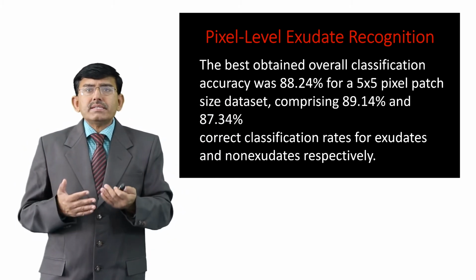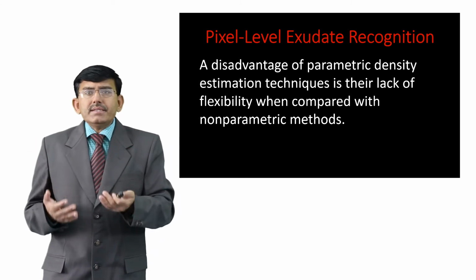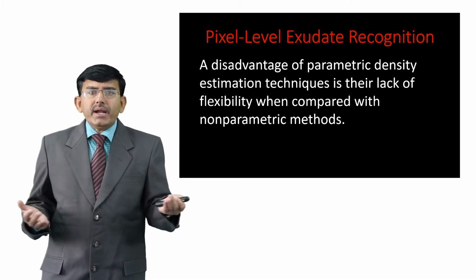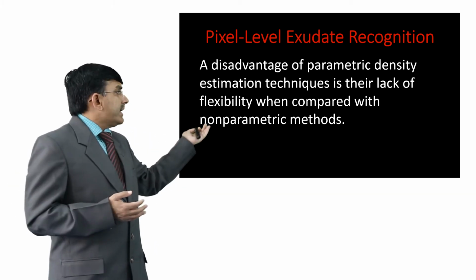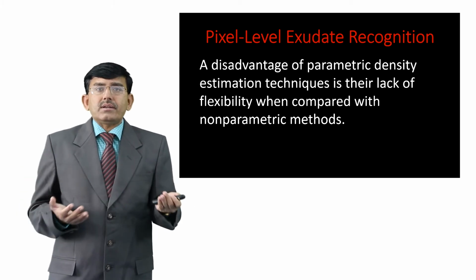A disadvantage of parametric density estimation techniques is their lack of flexibility when compared with non-parametric methods, which are used by other researchers.